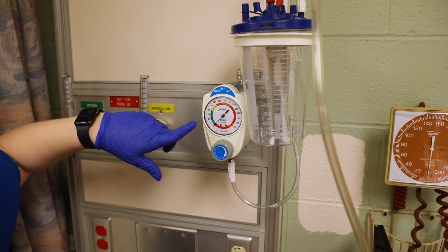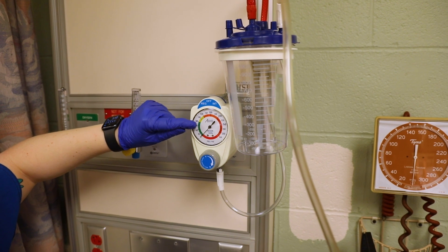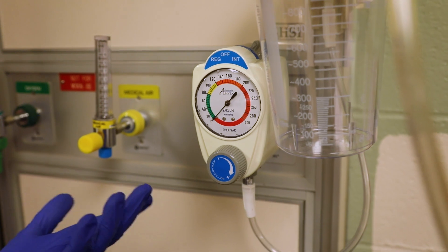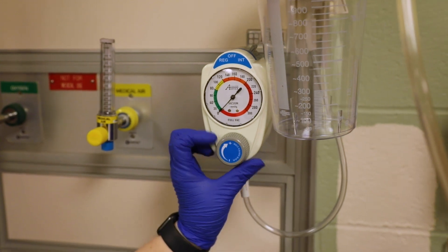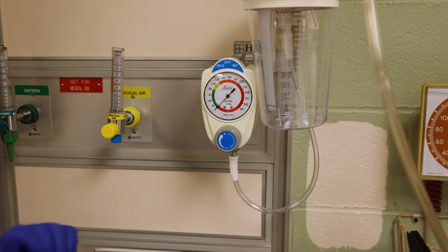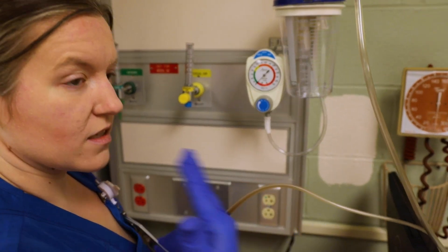You also want to look at your order. If it says low suction, it needs to be in the green; medium and high suction are progressively stronger. For this one the doctor ordered low intermittent suction, so I put it on low and then twist this until my arrow goes into the green. Now let's say the patient is choking and needs oral suctioning.